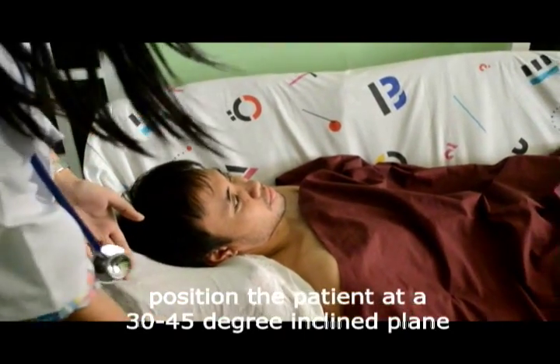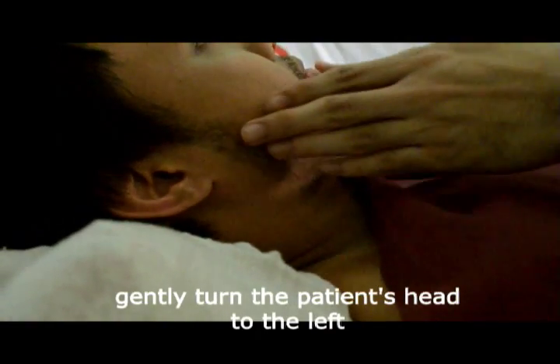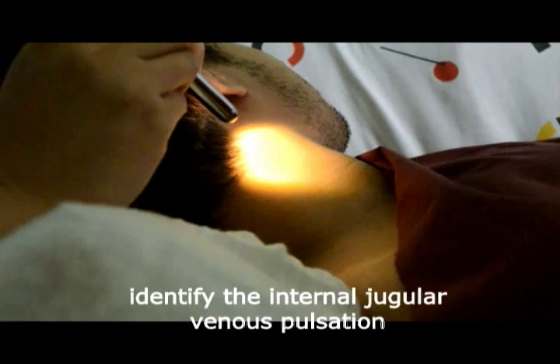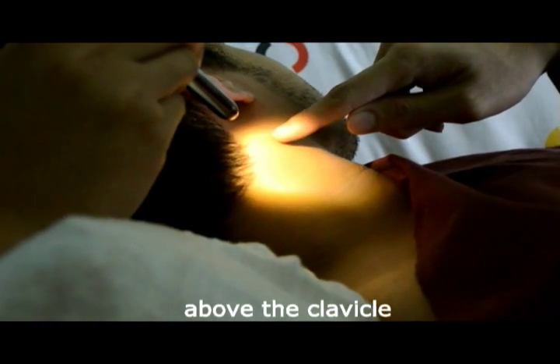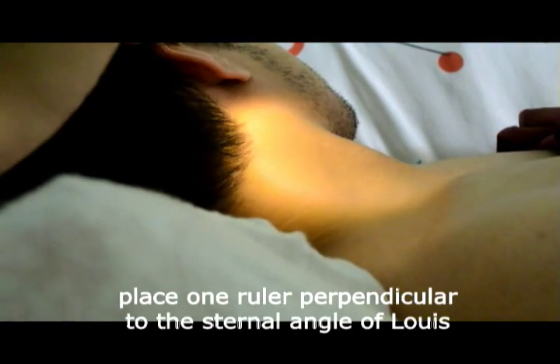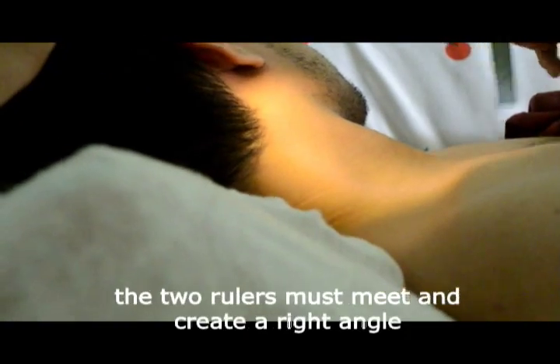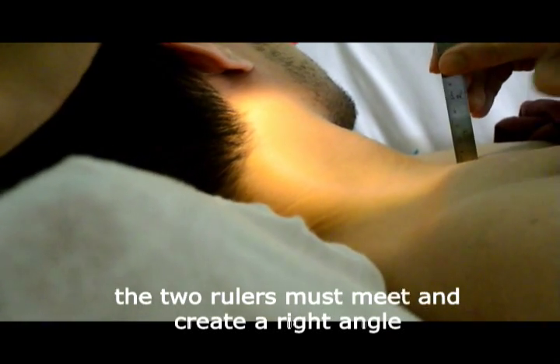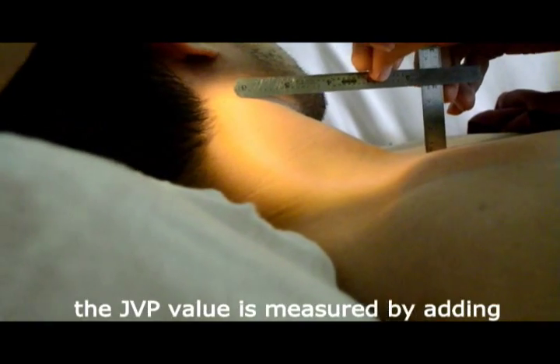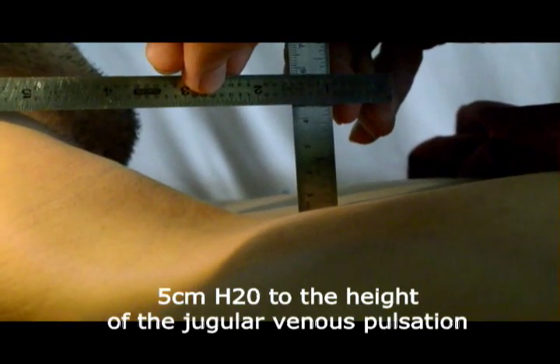Position the patient at a 30 to 45 degree inclined plane on the examination bed. Gently turn the patient's head to the left. With the pen light placed tangentially across the neck, identify the internal jugular venous pulsation above the clavicle. Using two rulers, place one ruler perpendicular to the sternal angle of Louis and the other ruler perpendicularly to the internal jugular venous pulsation. The two rulers must meet and create a right angle. Take note of the height of the JVP above the sternum manubrial angle. The JVP value is measured by adding 5 cm water to the height of the jugular venous pulsation.